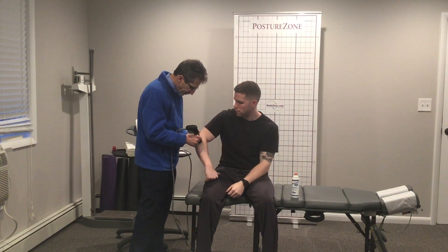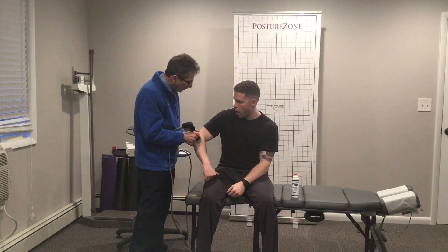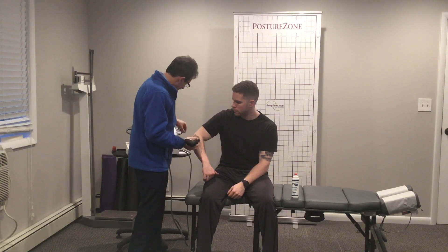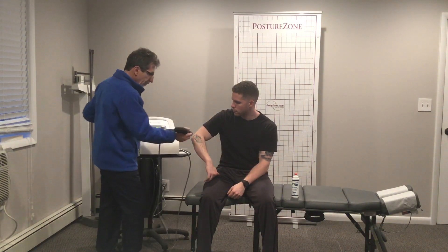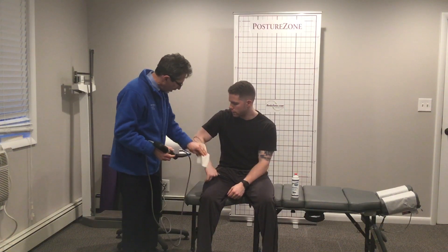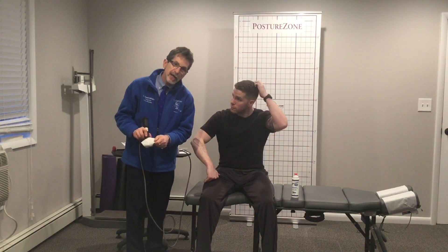By going at a fast pulsing rate — a little tender, Mike? A little bit. How sore was that on a scale of 0 to 10? A 6. We don't want it to go past a 6 out of 10 on the tenderness scale, maybe 7. So I would bring that down to maybe 1.1 bar.